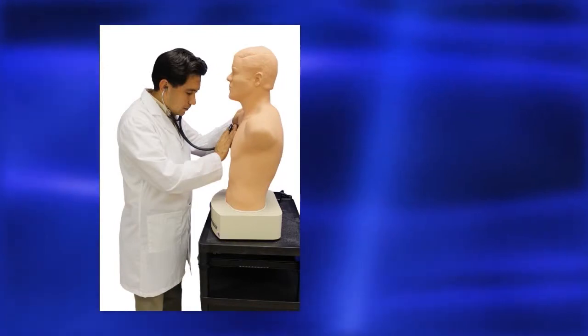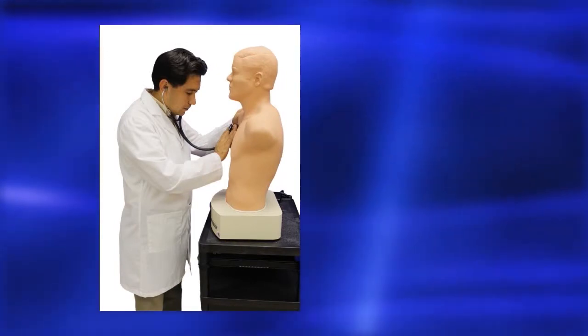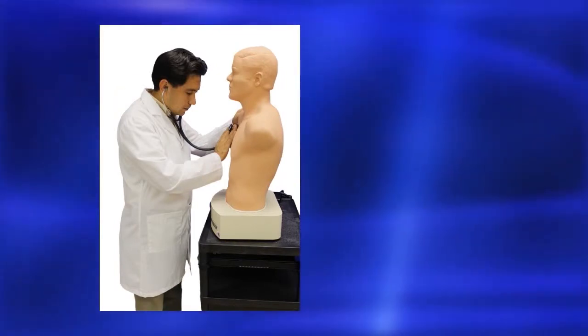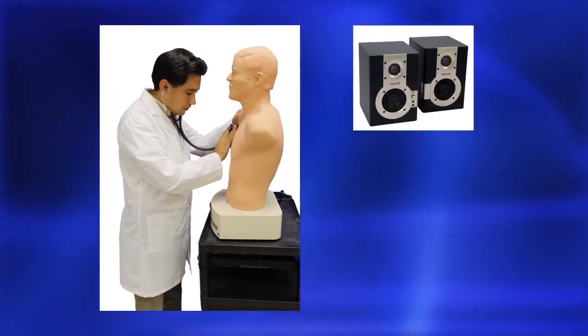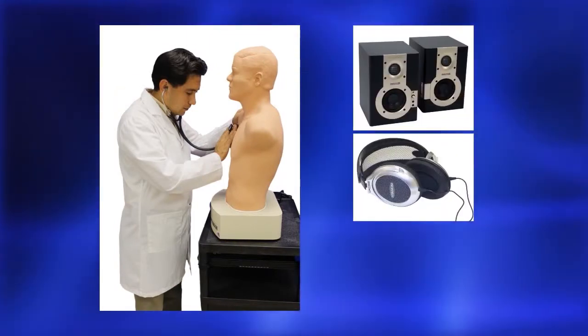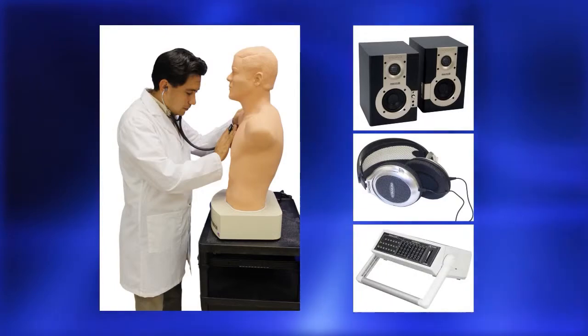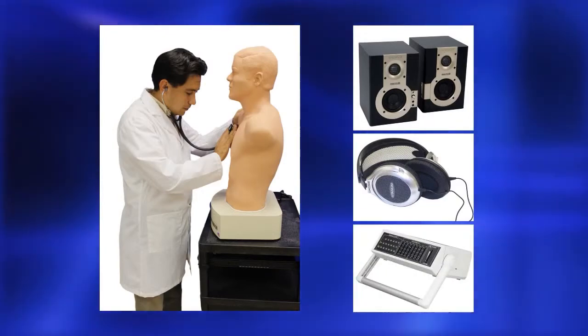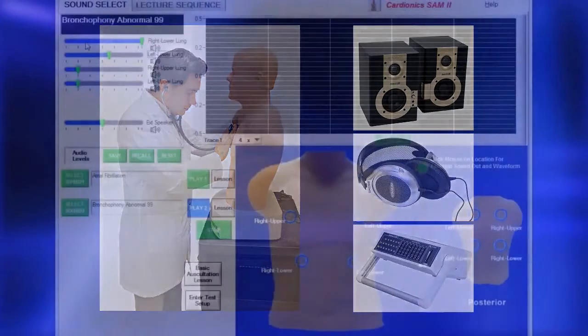Sounds can be heard on SAM2 using an ordinary stethoscope, a speaker, headphones, or the simulscope bedside auscultation system.